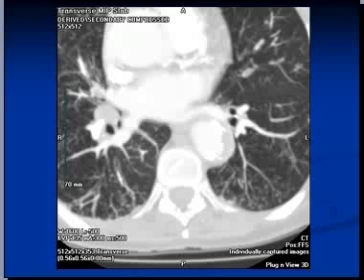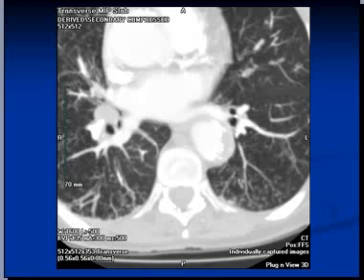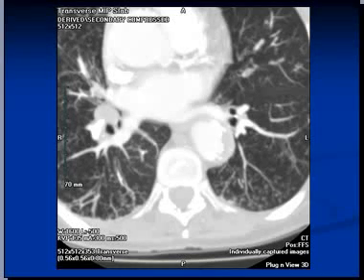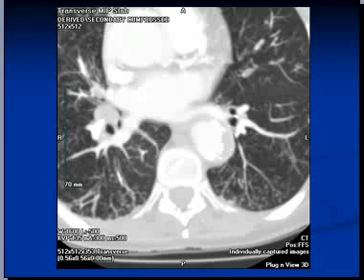The most common reasons for this pattern are conditions that cause bronchial dilatation and bronchial wall thickening, plus mucus plugging in peripheral branches. The pattern can only be seen on thin slices of CT scan and cannot be visible on any other modality.